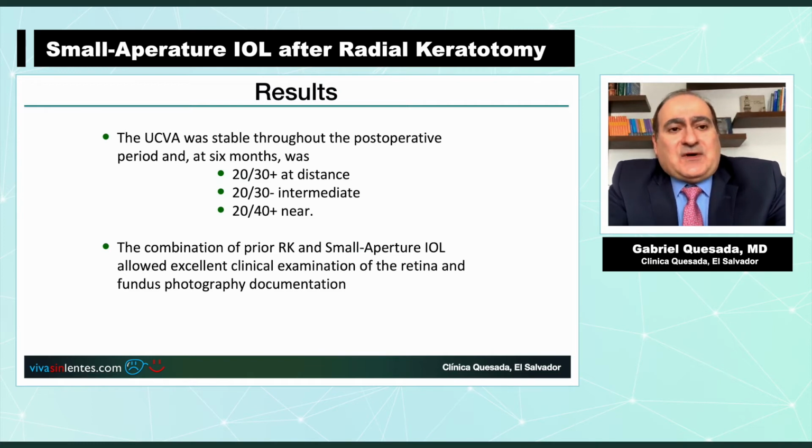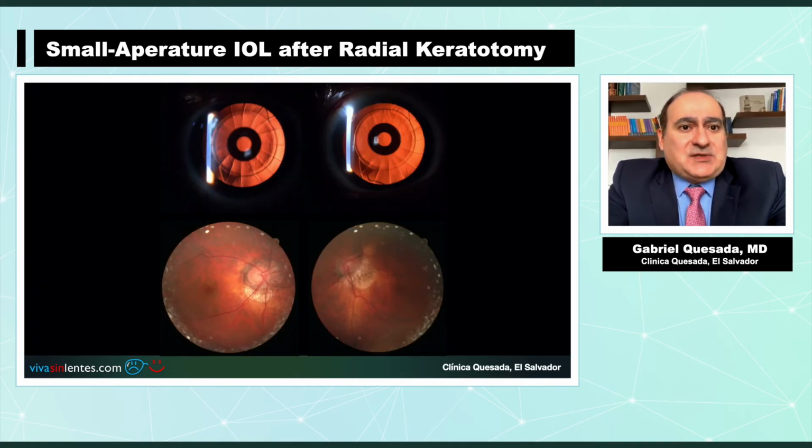The combination of a radial keratotomy and a small aperture IOL allowed excellent clinical examination of the retina and fundus photography documentation, as you can see in this slide.